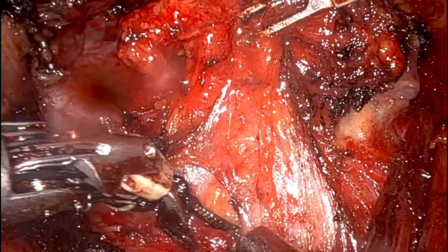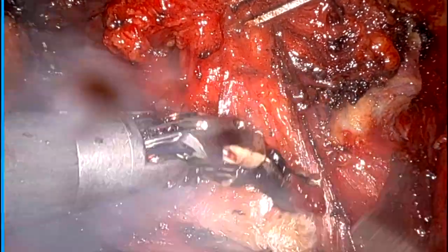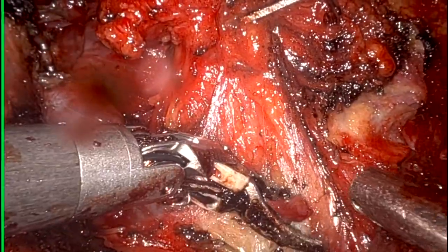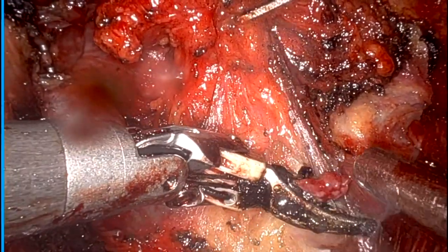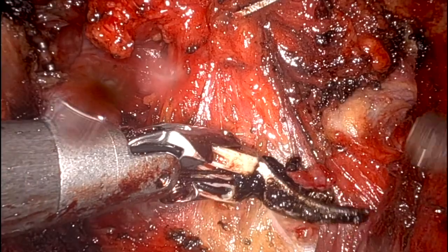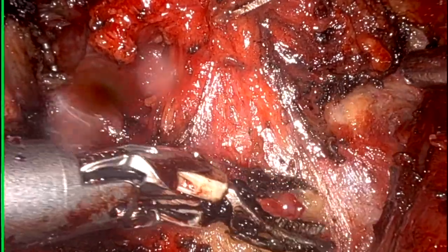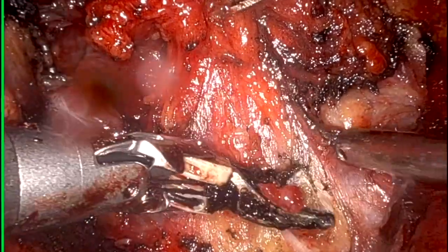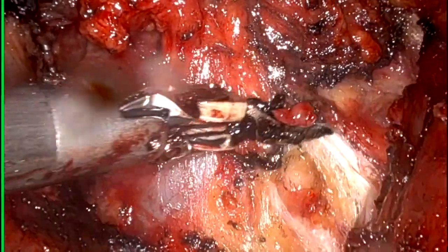Just watch my movements carefully. So I am creating the plane, buzzing the tissue and pushing this tissue towards my specimen. So this is the correct way of dissection. If I pull the tissue down, then I may break my specimen. So mind it, always push the tissue.